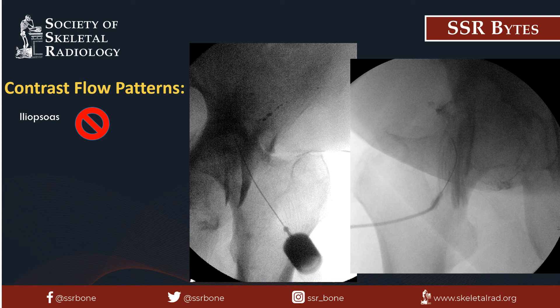This is an example of a contrast flow pattern along the iliopsoas myotendinous junction. Notice how the contrast courses in a linear craniocaudal orientation following the course of the iliopsoas muscle and tendon. If this is encountered, repositioning of the needle is required for intra-articular placement. Iliopsoas injections can be performed as therapeutic interventions when indicated under fluoroscopic or ultrasound guidance, and the trend is for these to be performed under ultrasound, which can also provide direct visualization of the close-by femoral vasculature.